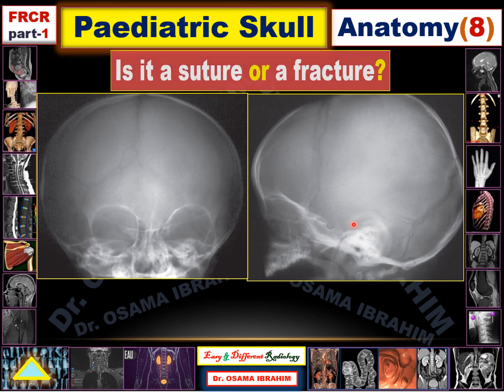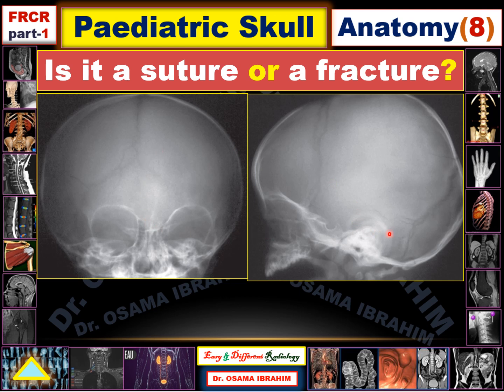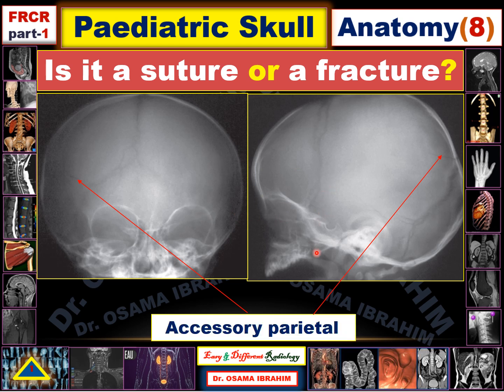Another case to determine suture or fracture. The coronal sutures, lambdoid sutures, squamosal sutures, and occipitomastoid sutures are identified. In the anteroposterior view, the sagittal and lambdoid sutures are also seen. There is one additional suture visible that does not extend to the temporal bone — this is considered an accessory parietal suture, not a fracture.